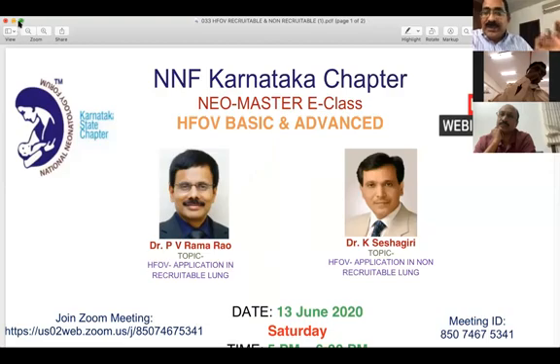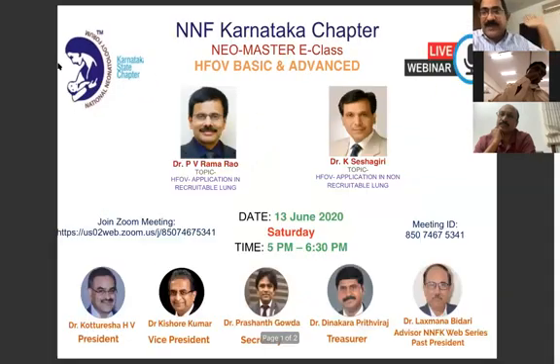Just because you're on the oscillator, that doesn't mean to say that you've nicely recruited and you're sitting on the deflation limb of the pressure volume loop. No, it doesn't work. You have to get there. So to get there, using various recruitment maneuvers, you should know what is the critical opening pressure. You need to know what is the critical closing pressure.